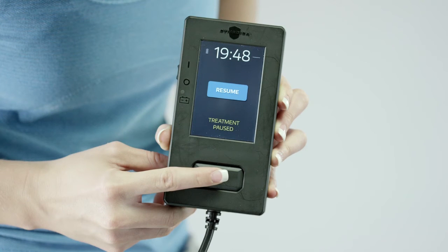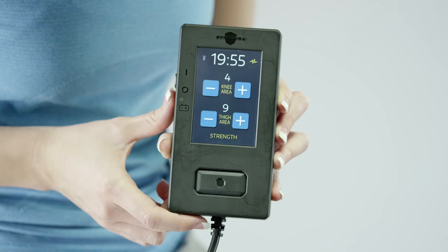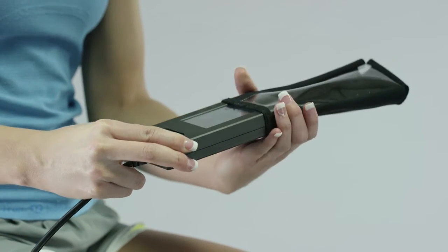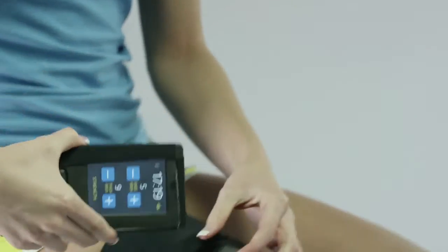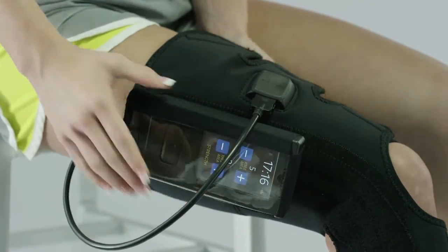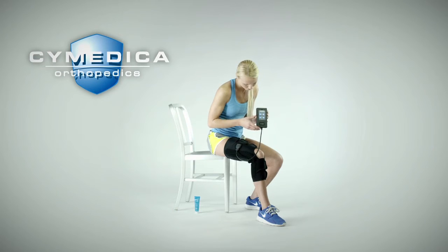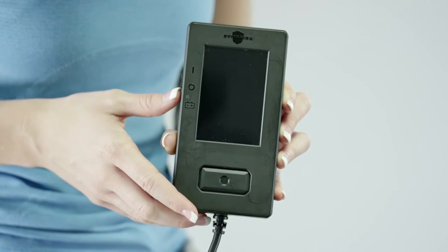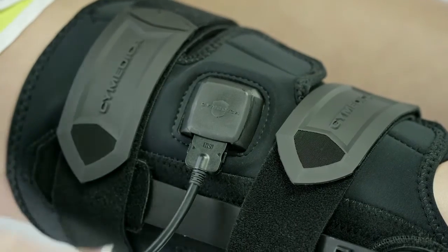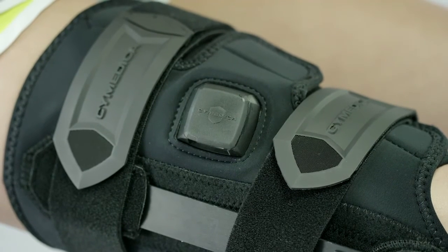You can continue to adjust the stimulation intensity with the plus and minus signs as desired. You should only make adjustments during the work period. During stimulation and to protect the user interface from various home related hazards, the user interface can be placed in the user interface pouch. For convenience, the user interface pouch can be attached to the conductive garment. At the end of the 20 minute treatment, the user interface will stop the stimulation and display a treatment complete screen. Turn off the user interface by sliding the on-off switch to the off position.